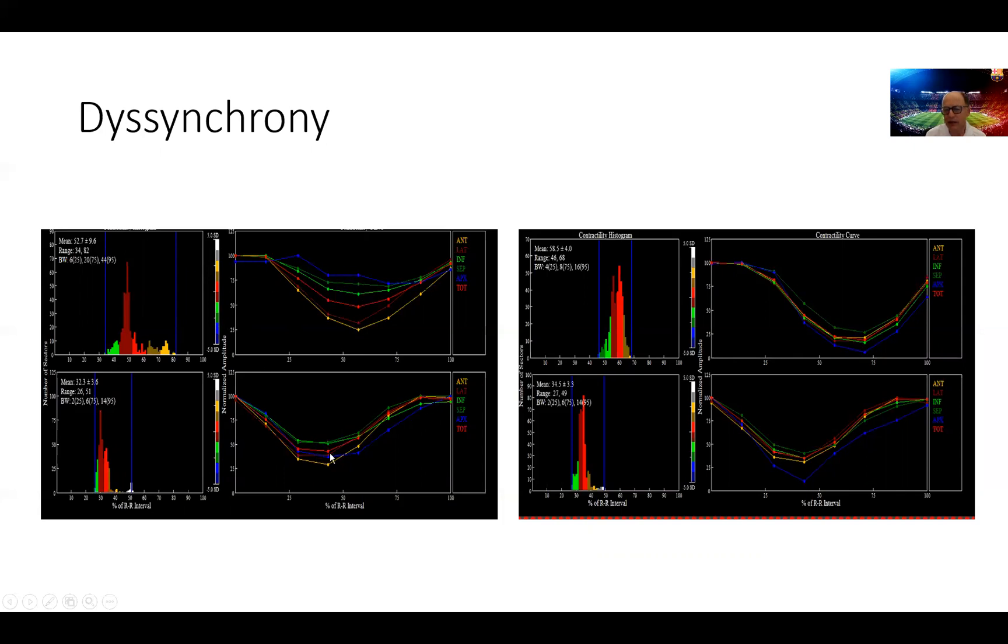This ventricle not only has ischemia, left ventricular dilatation, drop in ejection fraction, but becomes dyssynchronous in contrast to a study on the right hand side here where we have normal synchrony at rest and post stress. This is a normal observation on a normal patient and this is the patient we're dealing with right now when it becomes dyssynchronous.